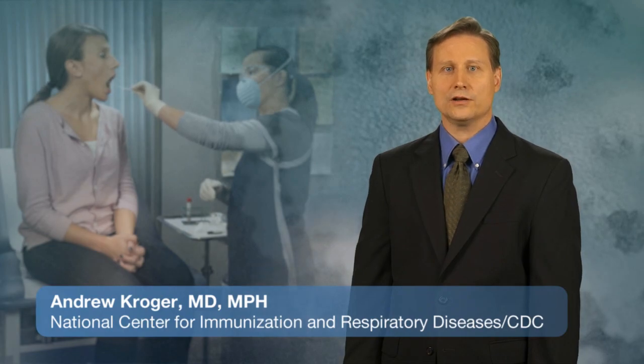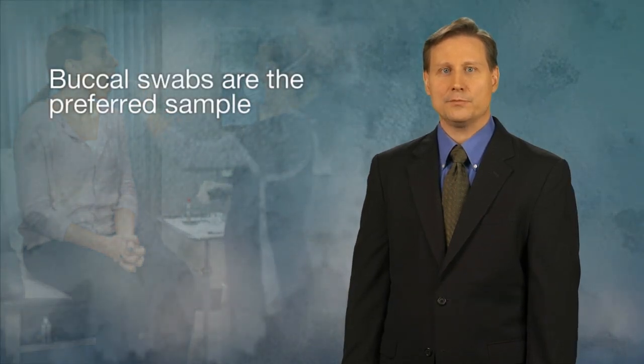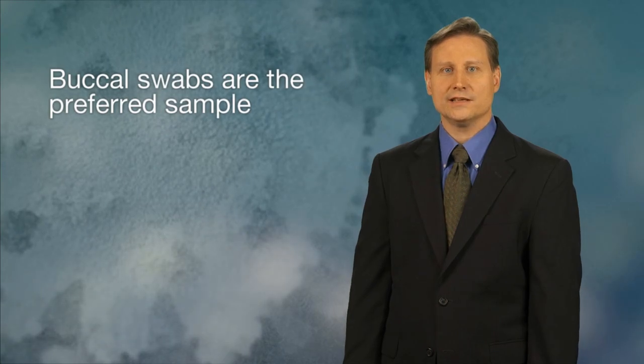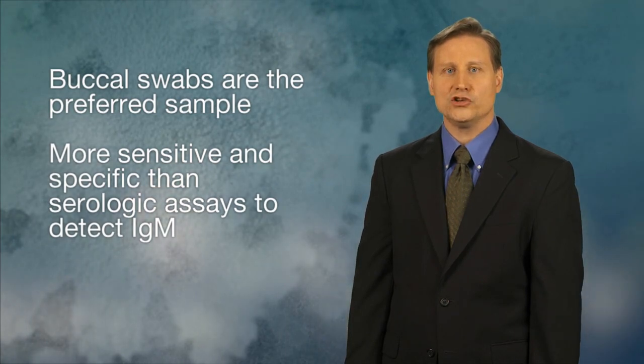This video will demonstrate how to collect a buccal swab for the detection of mumps virus. Buccal swabs are the preferred sample for confirmation of mumps infection, since viral detection assays, such as RT-PCR, are more sensitive and specific than serologic assays to detect IgM.